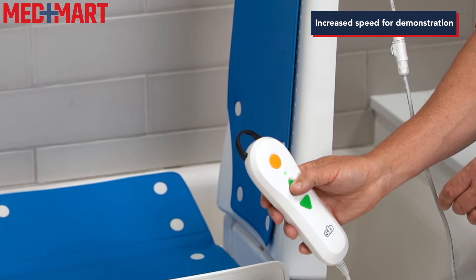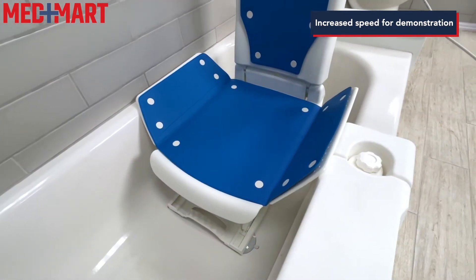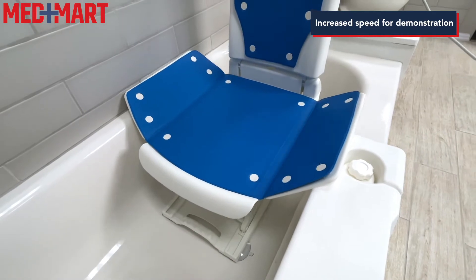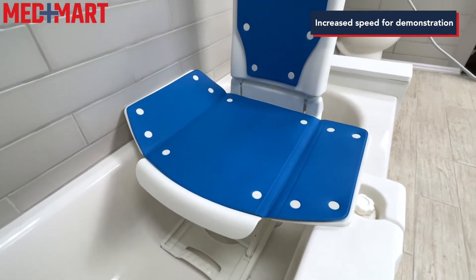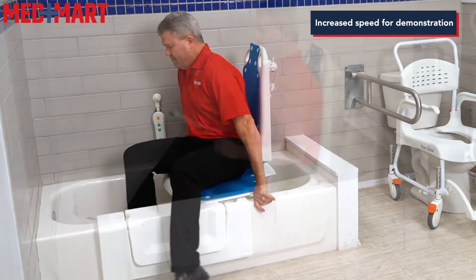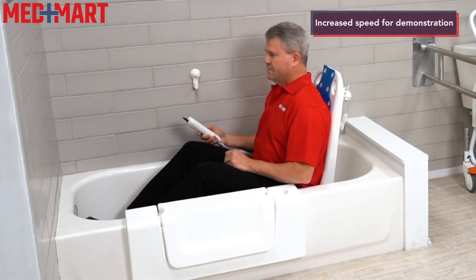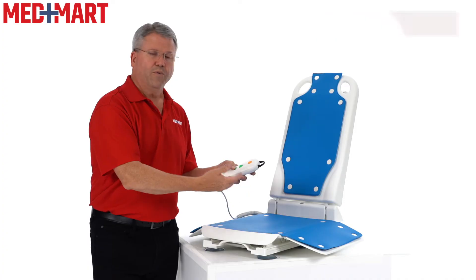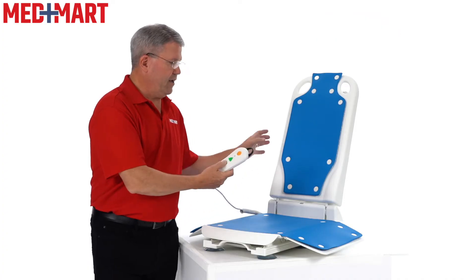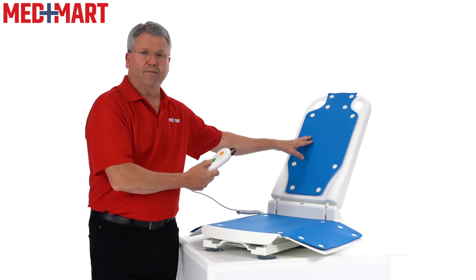This features an easy to use hand control with up and down arrows, which makes it easy to raise it up to tub level height. The wings fold out and sit on the edge of the tub, allowing you to sit on it, swing your legs over, and transfer into the tub. Then use the down button to lower down to about three inches above the bottom of the tub. Once it's all the way down, use the hand control to continue to recline the back to a comfortable position.